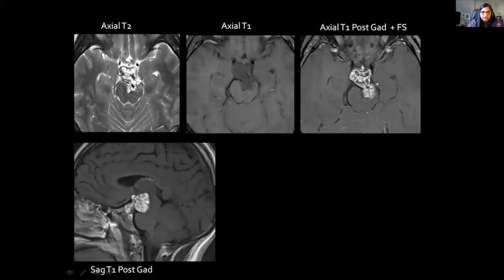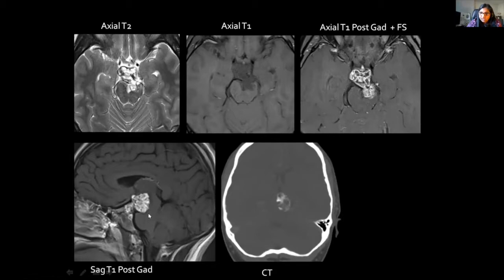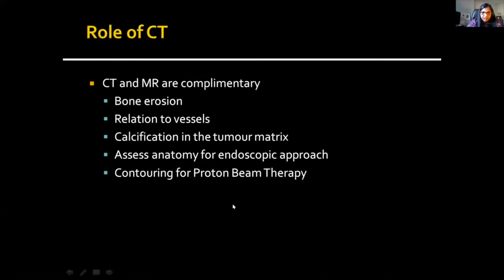A lobulated lesion centred at the level of the posterior clinoid processes, again quite high T2 signal intensity with low T2 signal intensity margins. On T1 it is low in signal and demonstrates fairly heterogeneous but avid enhancement. The sagittal T1 shows orientation of the lesion and distortion of the brain stem. Up until this point it would fit well for a chordoma — until I see the CT, which shows a very classical pattern of matrix mineralisation, favouring chondrosarcoma. The differentials are chondroid chordoma versus chondrosarcoma, and this midline lesion turned out to be a chondrosarcoma.